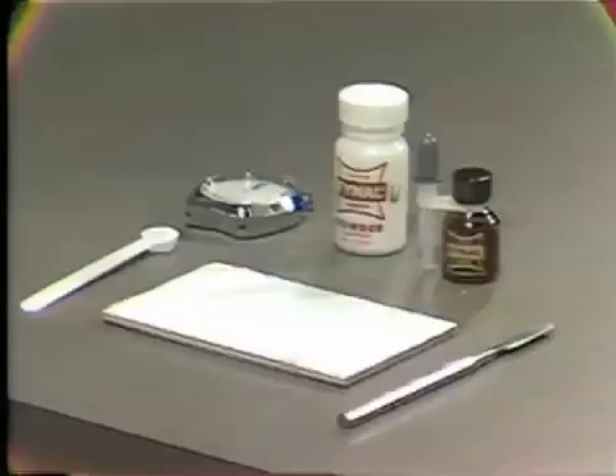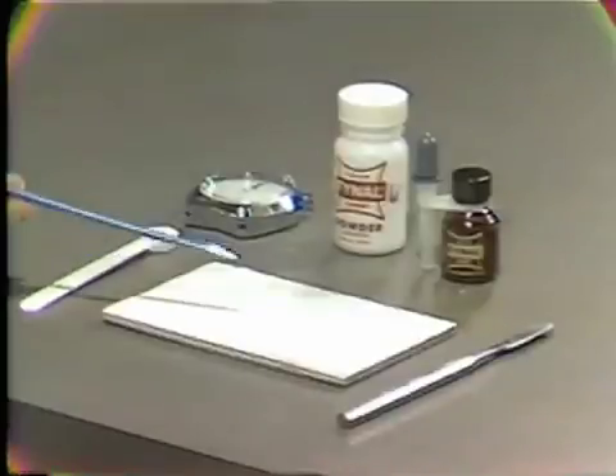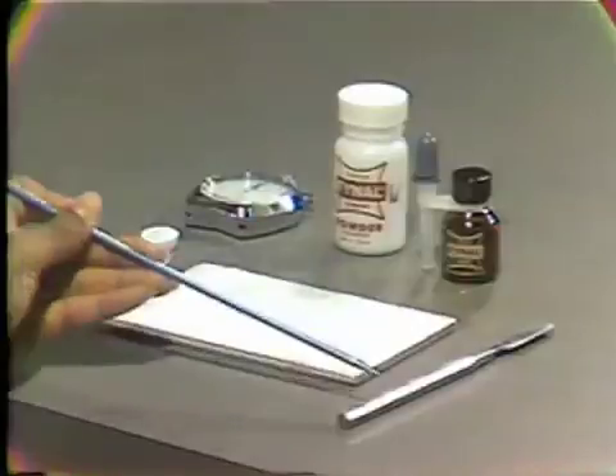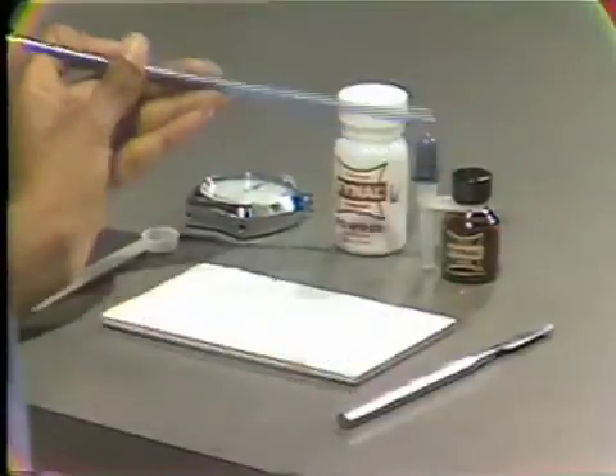Final is a zinc oxide eugenol cement used in the final cementation of inlays, crowns, and bridges. The materials needed for mixing are a stopwatch, the white Final measuring scoop, a 4 by 6 inch parchment pad, the 336 spatula, the cement liquid, and the cement powder.